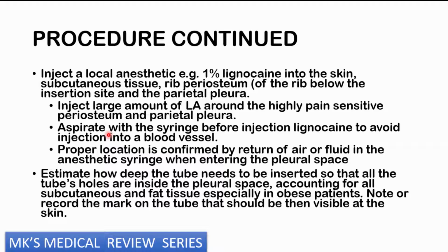The proper location is confirmed by air getting into the syringe as opposed to blood. And if you ensure that you're not in a blood vessel, you can start infiltrating within these structures and depositing the local anesthetic.